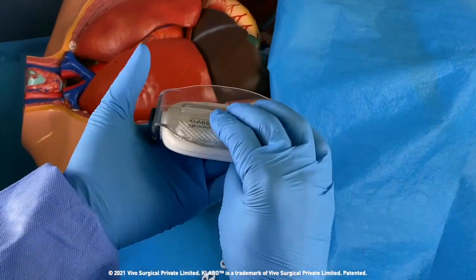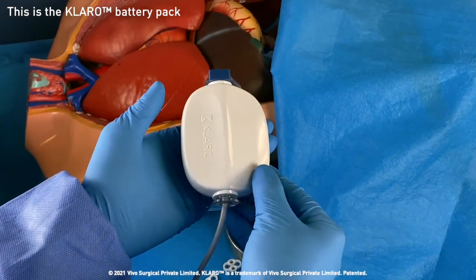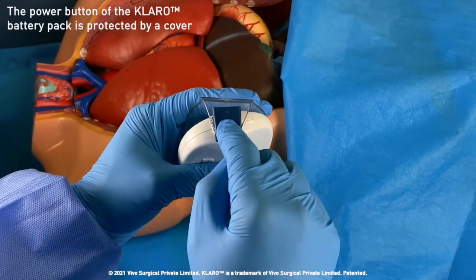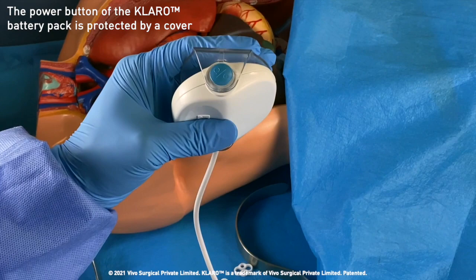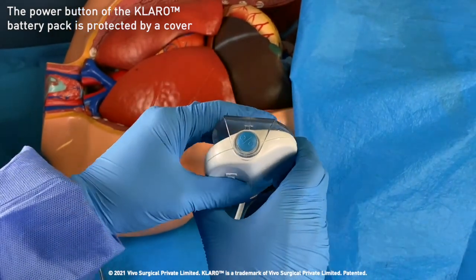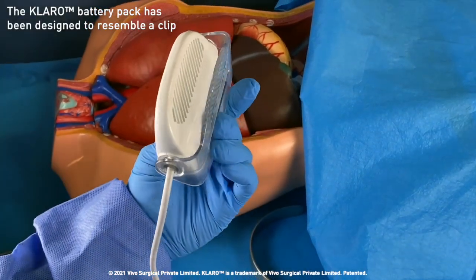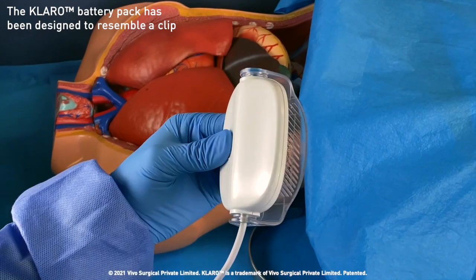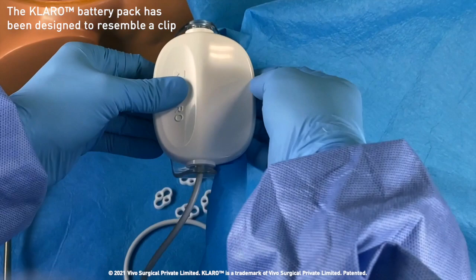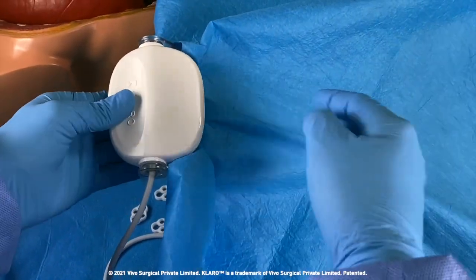This is the Claro battery pack with the product label affixed at the back. Remove this blue button cover to reveal the power button that is easily accessible by the surgeon. The Claro battery pack has a transparent base allowing it to function as a clip, which the surgeon can fasten to surgical drapes before surgery. It can be secured quite firmly, as you can see.